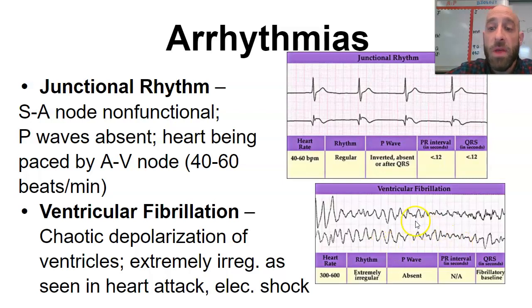But in this scenario, there's no P wave, there's no QRS, there's no T. It's just a big disaster of a graph here, really. So that's it.